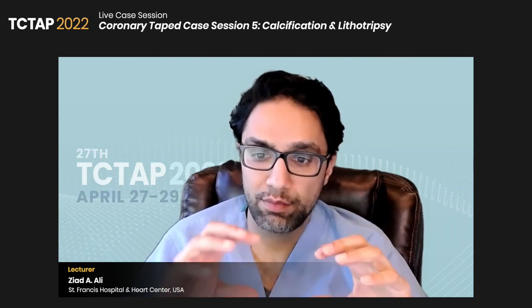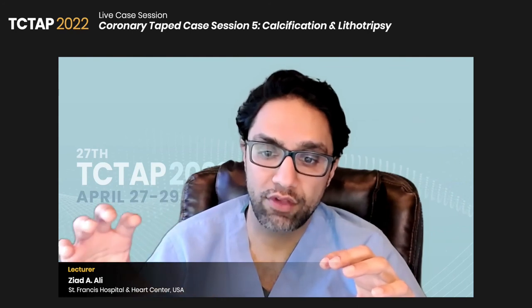So our strategy is to deliver up to half of the pulses in the most angiographically calcified segment. We call that a power surge. And then we use pulse management to distribute the remainder of the shocks along the length of the lesion to make sure that we modify the calcium throughout.